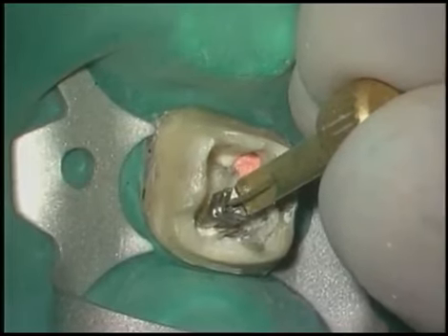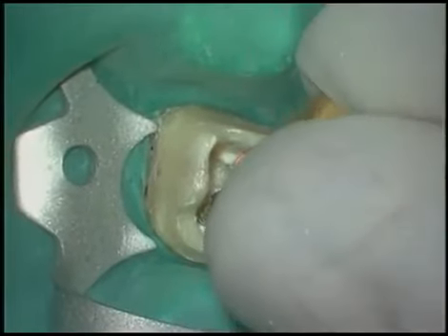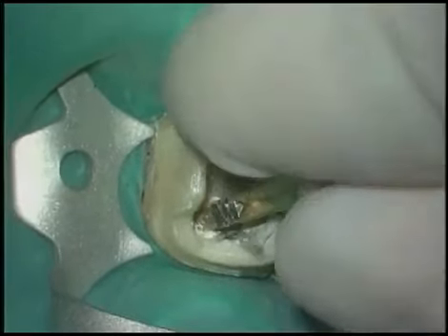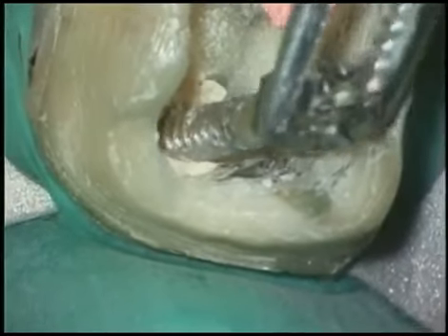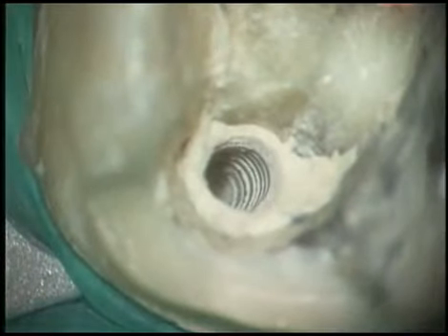Most post systems, like threaded post systems, have engaging tools, and we can use an engaging tool to try the simplest way to encourage removal. In this case, little short counterclockwise strokes begin to back the post up, and the post is liberated from the root canal. You can look down in the canal at high power, and you can see that about 15x, you can see the thread lines or thread marks in the cement wall.